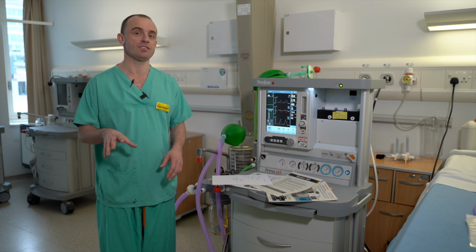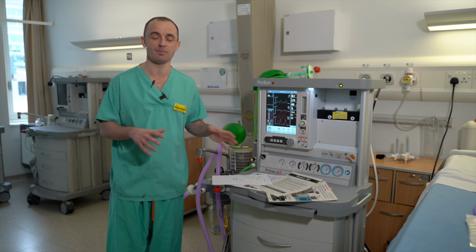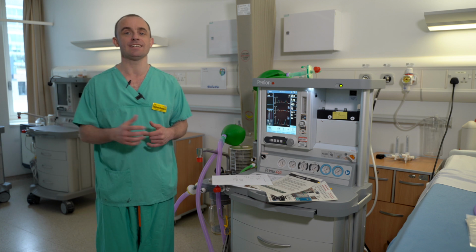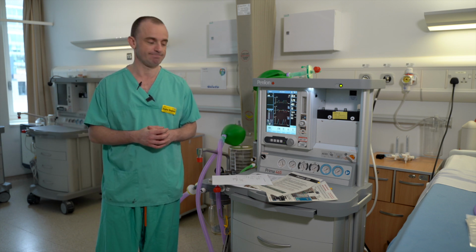All mode changes should be made by an anaesthetist. We've shown you how to set some of the parameters, but we're recommending that they are made by one of the doctors as familiarity increases.